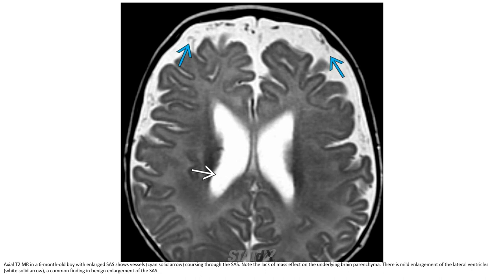This is a T2 MRI in a six-month-old boy with large subarachnoid spaces. Note the vessels coursing through the subarachnoid spaces and the absence of mass effect on the underlying brain. Mild lateral ventricular enlargement is a common finding in benign enlargement of subarachnoid spaces.